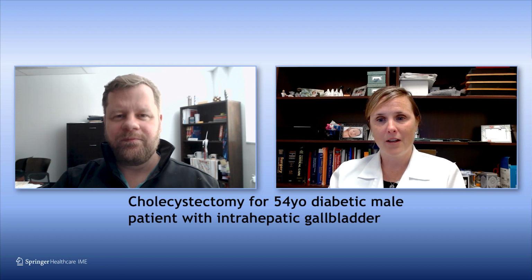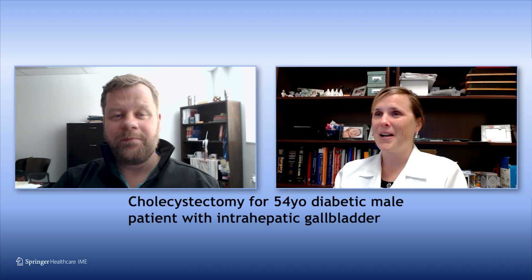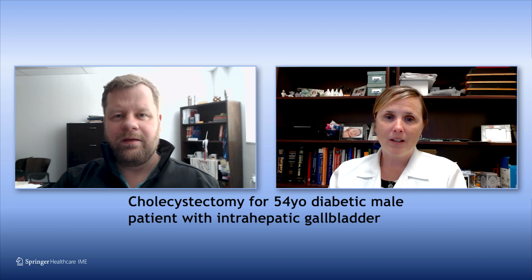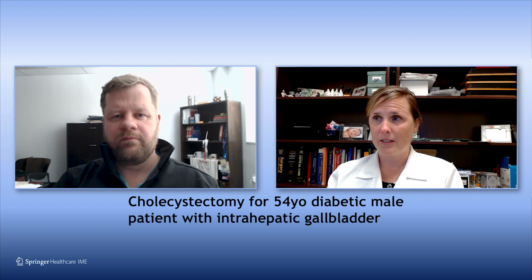But if you walked in the operating room and looked at the laparoscopic screen, then you would maybe know what you wanted to go for, because it's not always describable. So just as a reminder for discussion points, you want to think about clinical factors. This patient that we're talking about should have an intact coagulation system. So from that sense, they would potentially be a candidate for physical agents, and those are generally much cheaper. So if you have something like Surgicel that you can lay on the liver bed, and that can do the trick, then that might be your cheapest option. So I think it's worth considering.